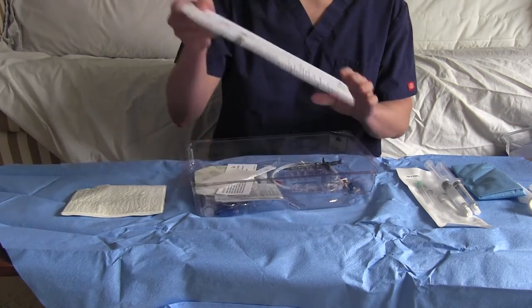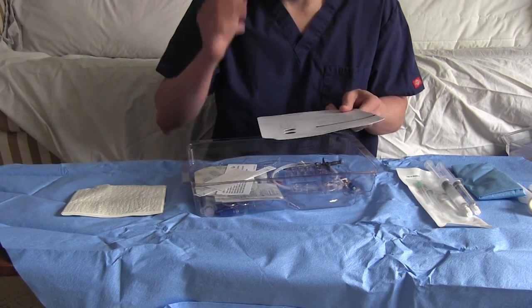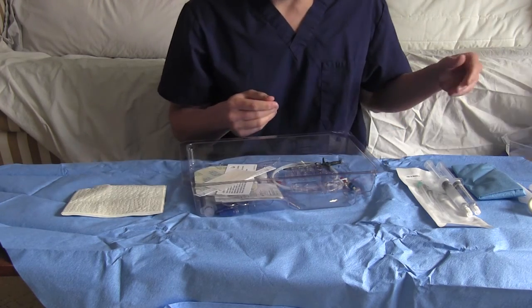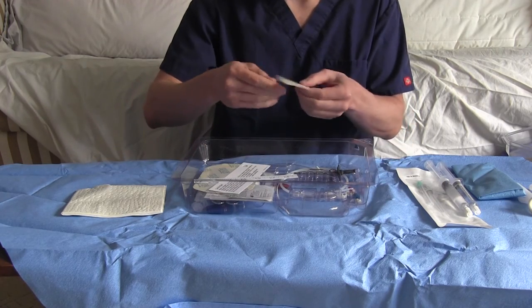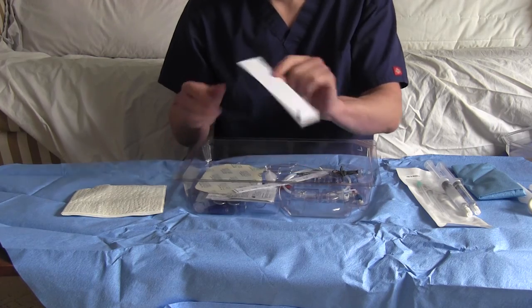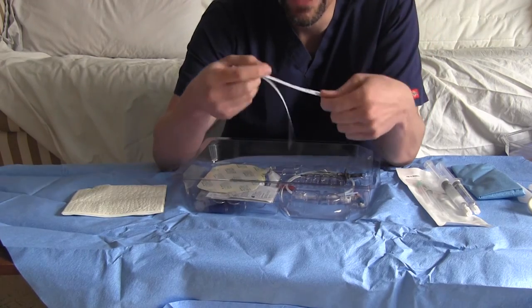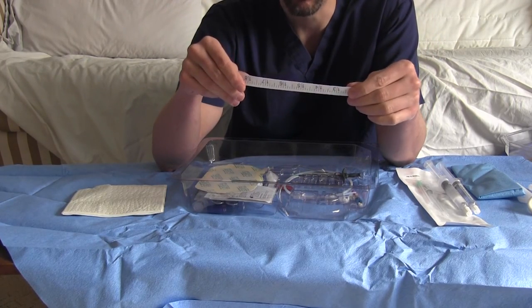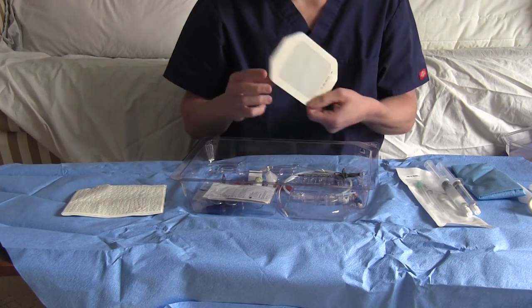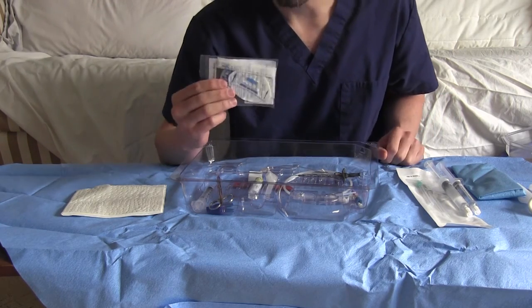There is then a procedural checklist if you wanted to hand this off to your assistant and let them check off the steps of confirming the patient, site, prep, was the wire out, blah, blah, blah. You know the deal. Okay. Now, steri strips for eventual securing. A cautionary note. We'll talk about what that cautionary note says. Another tape measure in case your site changed slightly and you want it to remeasure. A Tegaderm. A StatLock. We'll talk about that.